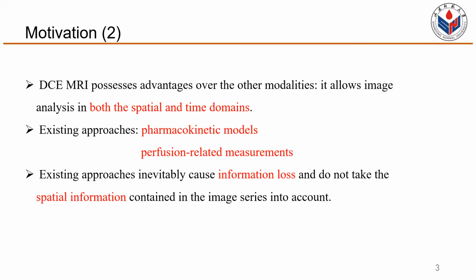However, DCE MRI possesses advantages over the other modalities, that is, it allows image analysis in both the spatial and time domains. Therefore, it is important to further explore the potential of DCE MRI in prostate cancer detection.